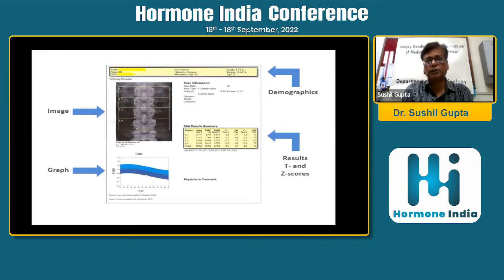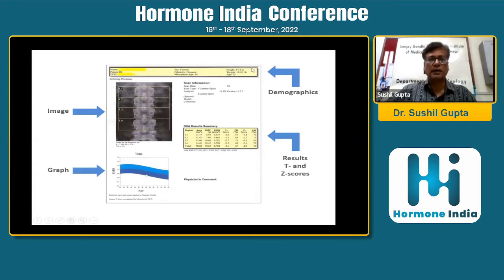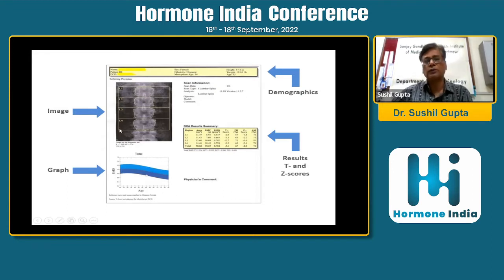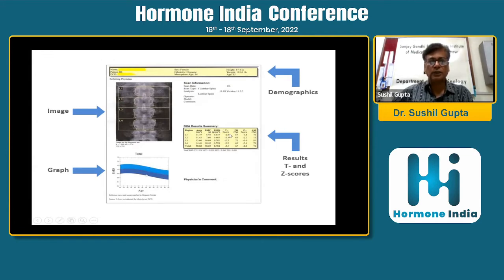A DEXA scan report of the lumbar spine shows demographics at the top — name, height, weight — along with the spine image, T-score, Z-score, and a BMD graph plotted against age. One has to look at demographics, the image, and the T-score and Z-score. The lumbar spine table includes regions L1, L2, L3, and L4 vertebrae, with the total being L1 to L4, showing area, bone mineral content, bone mineral density, T-score, and Z-score.